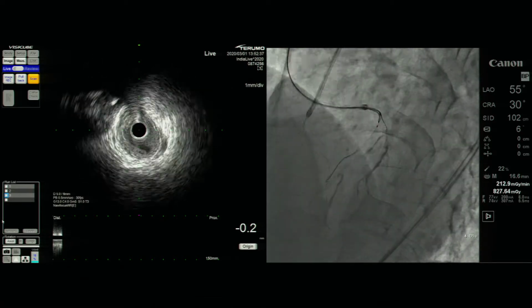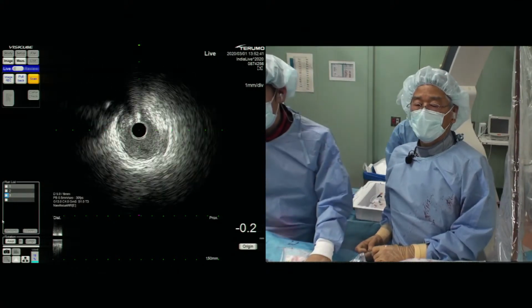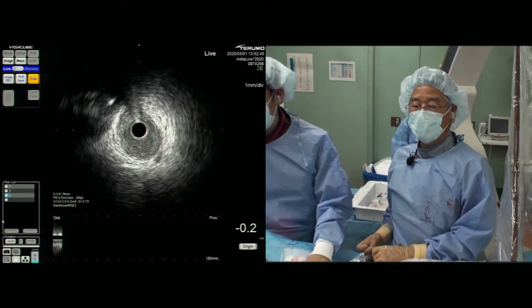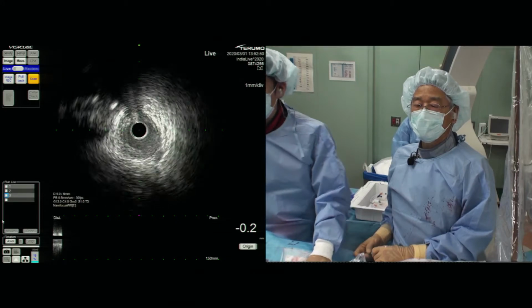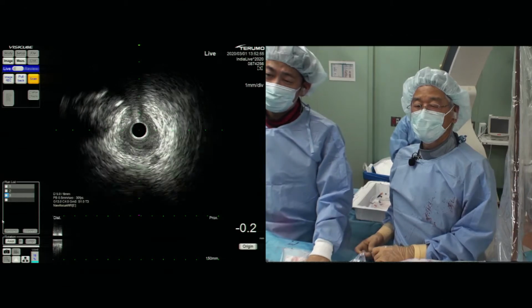So that extra bend which helped us to get into the CTO body will be a pain for us now as we walk through the CTO body. The second bend is helpful to get into the CTO entry, but not good after that. The wire control is a pain after that.